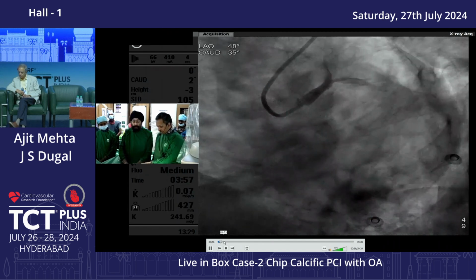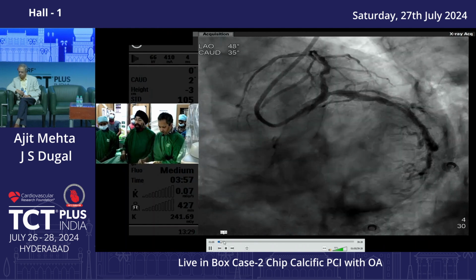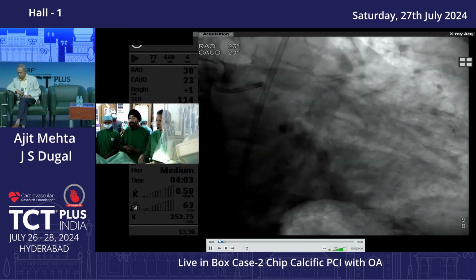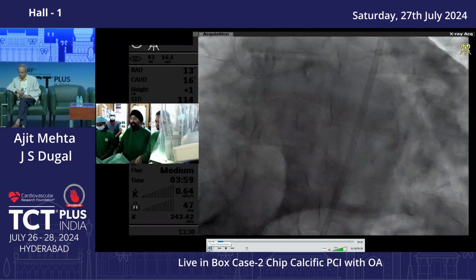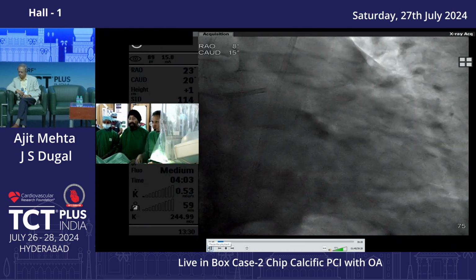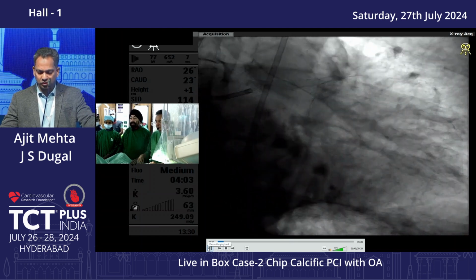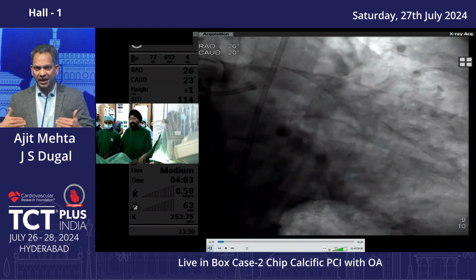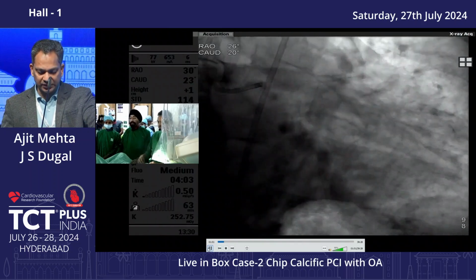At the site of the lesion, there's a tight disease at the ostioproximal circumflex. The right coronary artery also had about 70-75% disease in the PD. So this was a dry run just to show the significant calcium at the proximal part of the LAD, tram-track calcification.